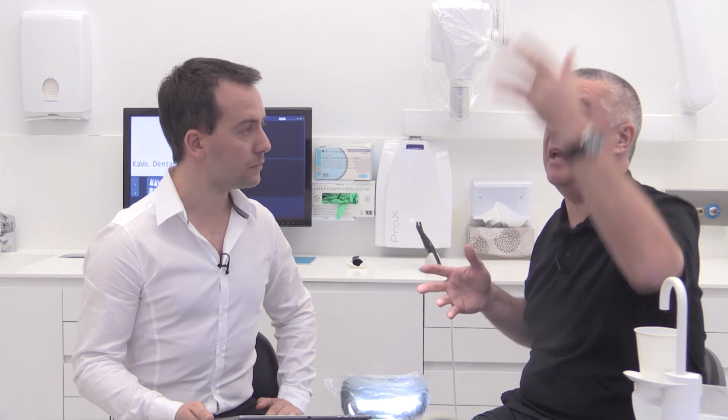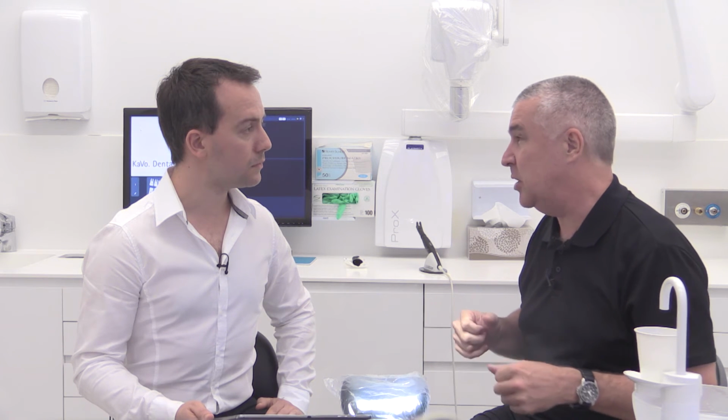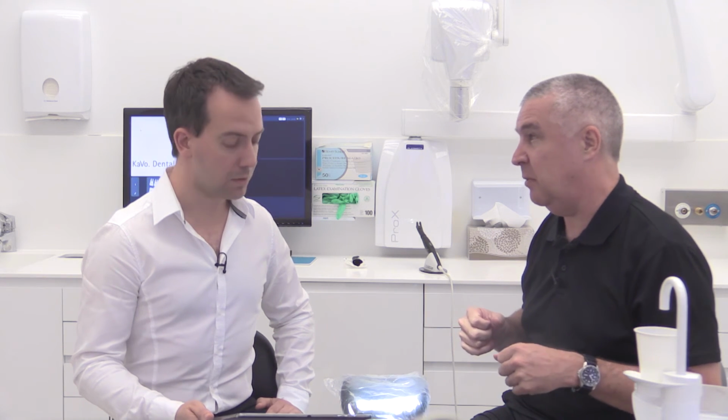The LED lights don't throw out infrared light, because a white LED light, as we have in modern operating lights, is actually a blue LED with a phosphor. And those two things don't emit any infrared, so they don't really mess up the image to any great extent. So with a modern LED light, the answer would be it shouldn't make any difference. With an old halogen light, it could, so I'd be moving it away.